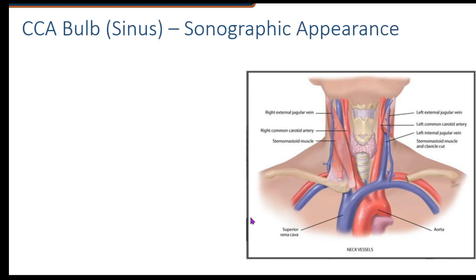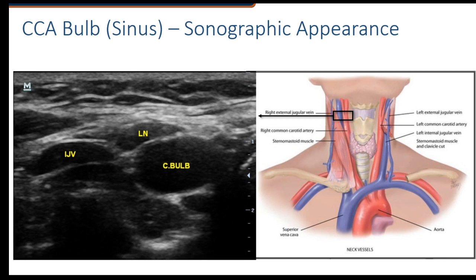Now, if we move further up on the neck, where we get to the distal portion of the carotid, and this is where the bulb is, or the sinus, you know that you have some baroreceptors and some chemoreceptors there. And this is where you get an enlargement to that distal end. And this enlargement will display itself. You can see the big difference between the size you saw on the previous slide to the size of the carotid here.